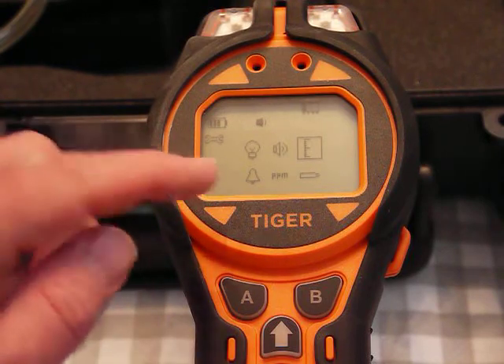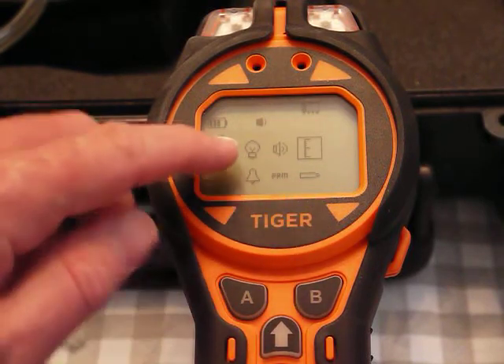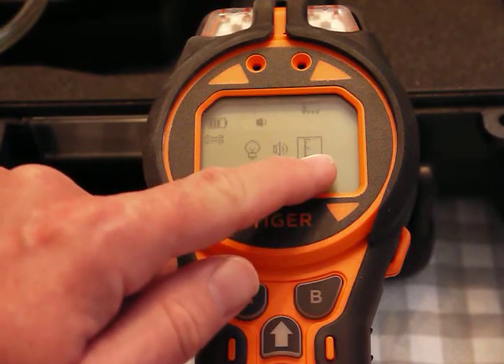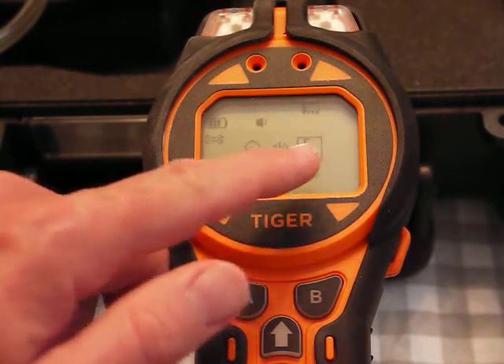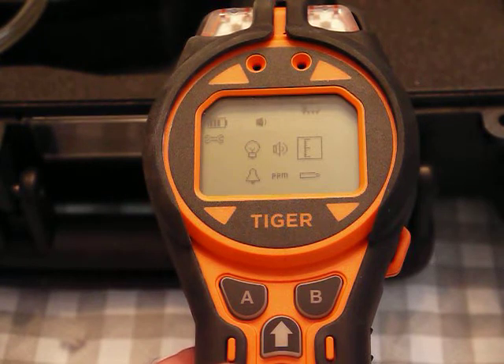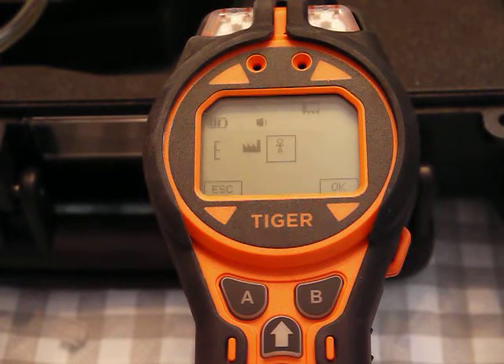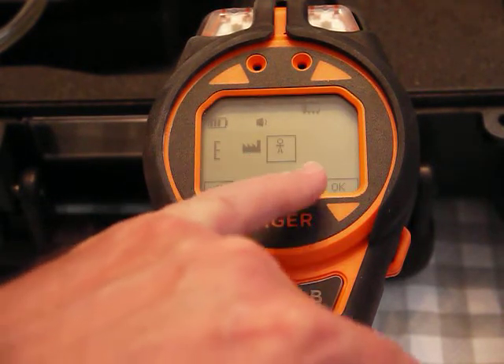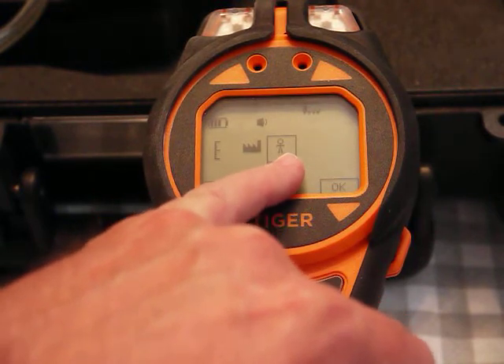The wrench is over here so the B button is under the wrench — I click that. Now I've got different options: I can control the backlight, control the sound, and this one is for calibration — it looks like a ruler basically. I hit enter using the on/off button.